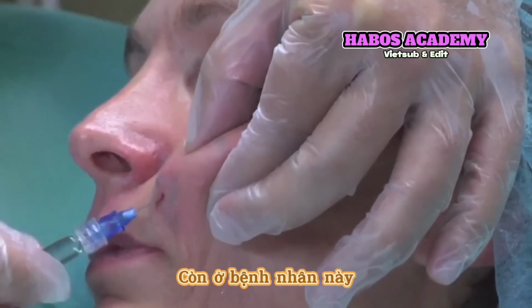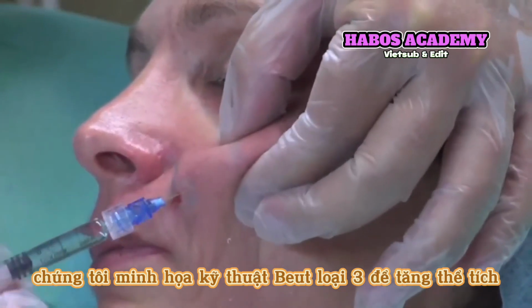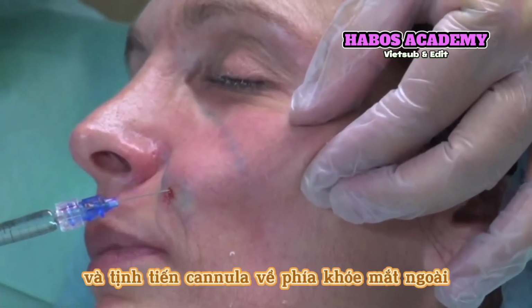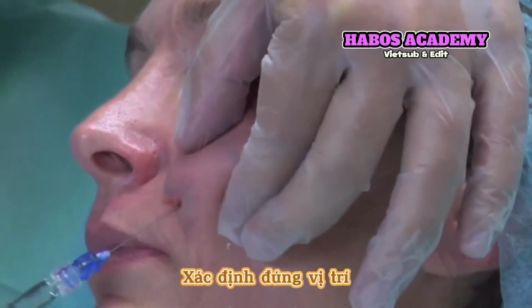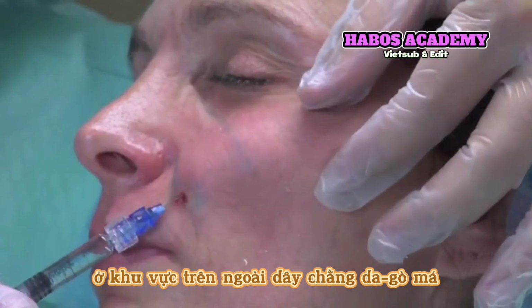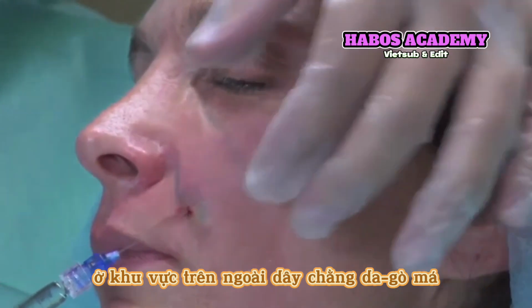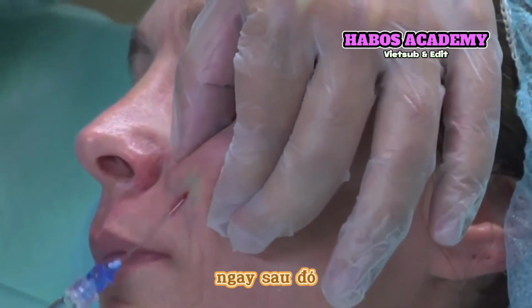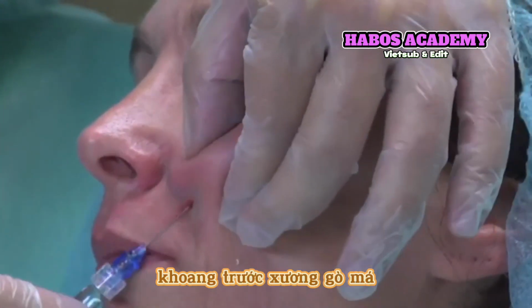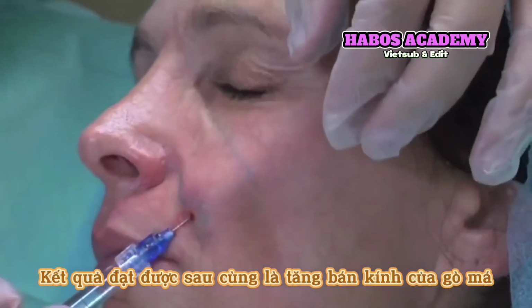In this patient, we demonstrate type 3 volumization. A pinch and pull of the cheek in line with the lateral canthus ensures proper position. A superficial fill is placed cephalic and lateral to the zygomatico-cutaneous ligaments. Medially, the inferior limits of the prezygomatic space are volumized. The end result is a greater radius of the cheek.